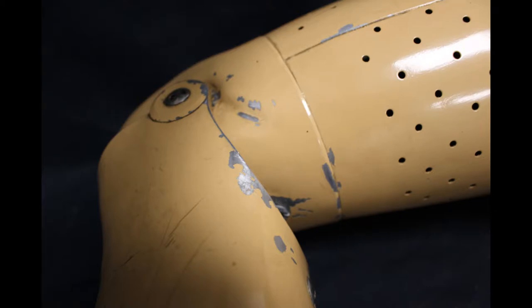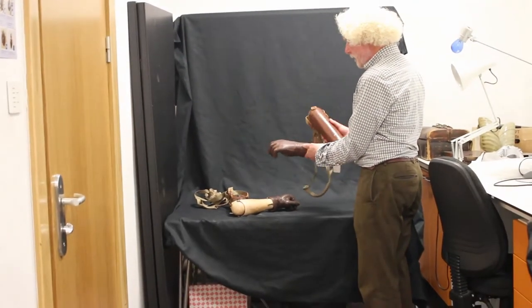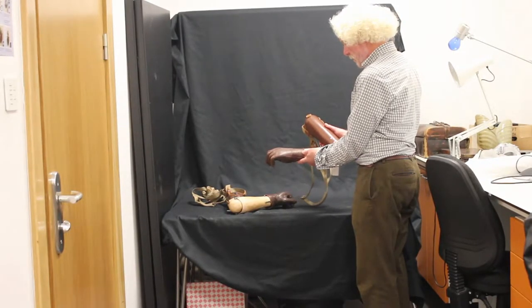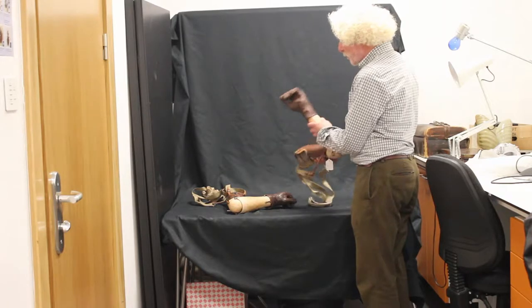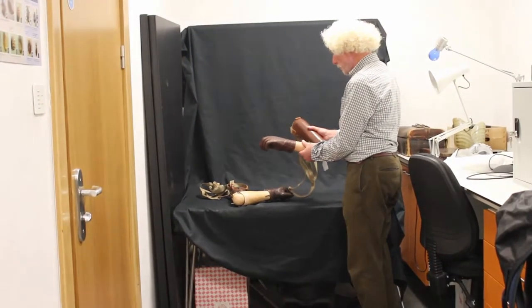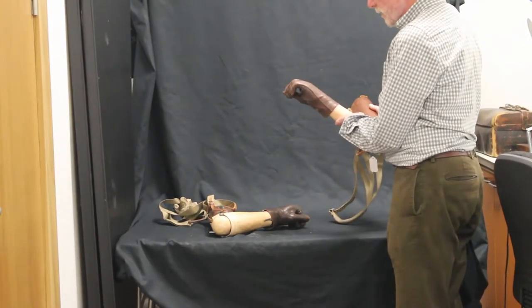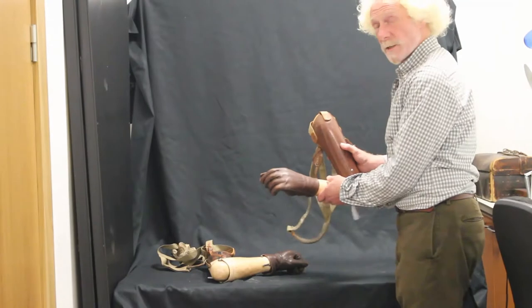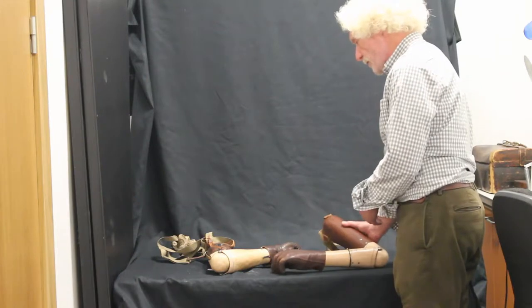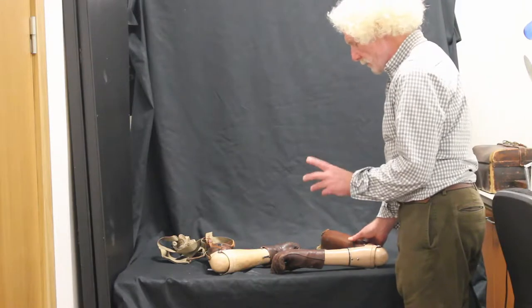Here we have two full arm prostheses. These are actually both from the same patient. We know that the patient had his arm amputated when he was 19 years old, and these limbs were found in an attic when the house was cleared. They look very similar, and they are, but there are minor differences between the two.